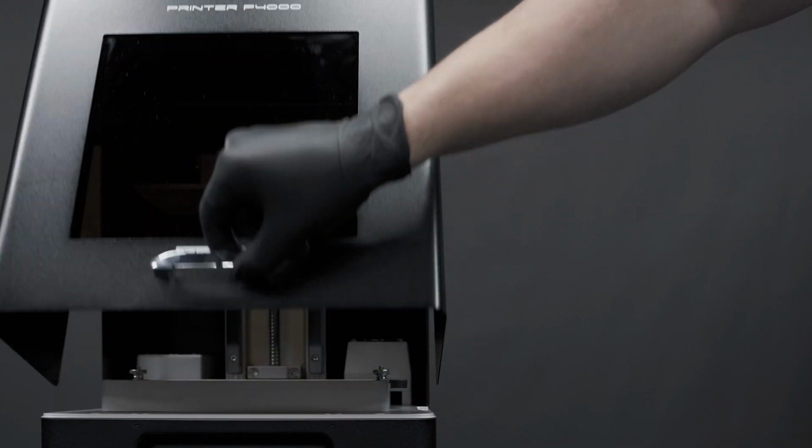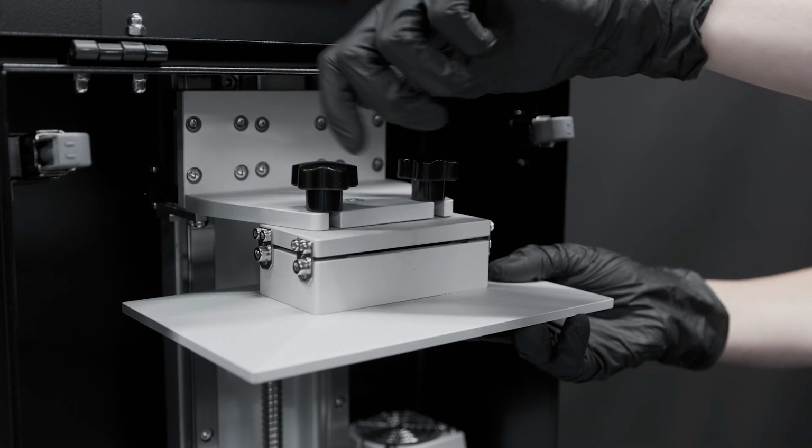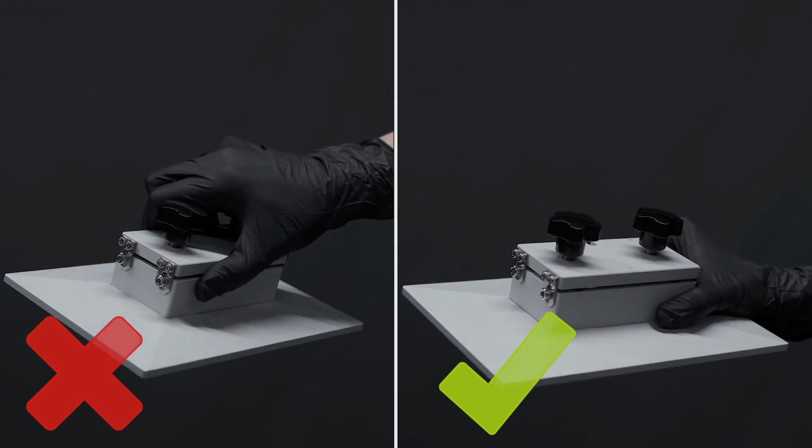Open the printer chamber and remove the building plate with caution. Pay attention to how you hold it, avoiding pressure on the fixed screws.